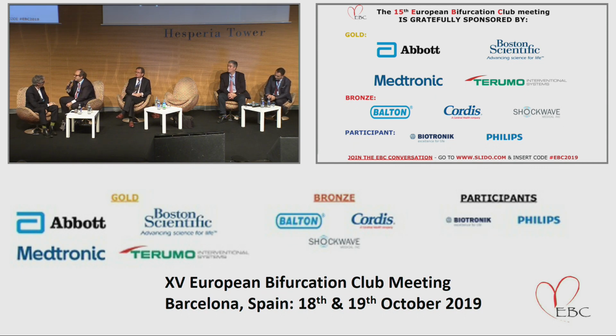Thank you. In your clinical practice, how many left mains need to go up to 5 millimeters? Because you can reach 5 millimeters with a conventional stent. So the main indication for this new design may be very big left main. Yeah, a proportion, a percentage.